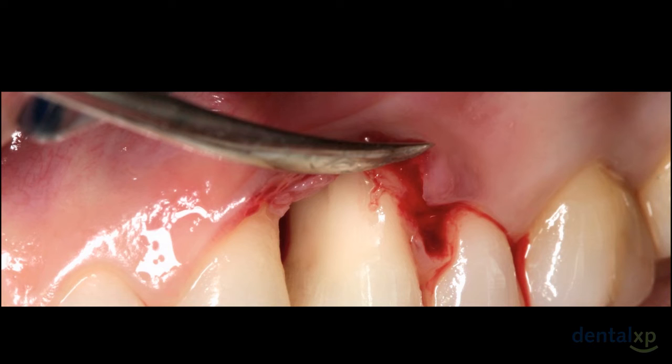After spending a good half hour, I was able to remove the mesiobuccal line angle as well as the mesiolingual line angle. What this means is that floss will work and a curette will work. I then went in and smoothed any remaining calculus from the concavity, or furrow if you want to call it, from the mesial of number 12. So the root surface was cleaned totally, and then we placed our Emdogain, BioOss, Collagen in the area.